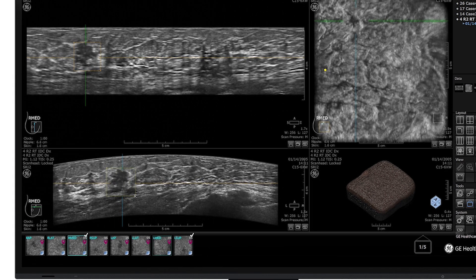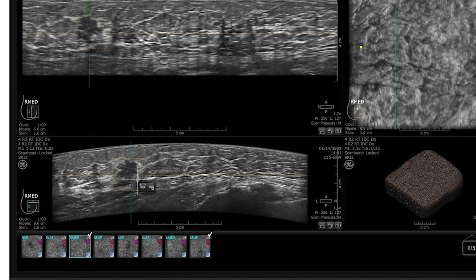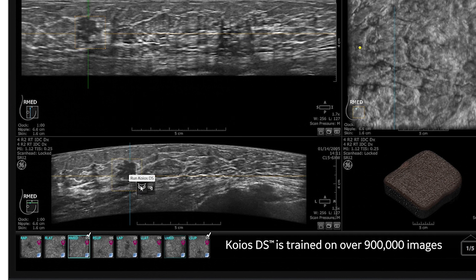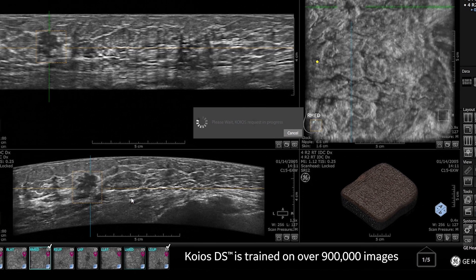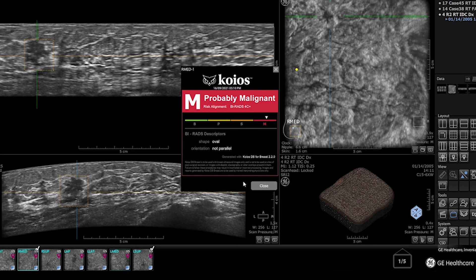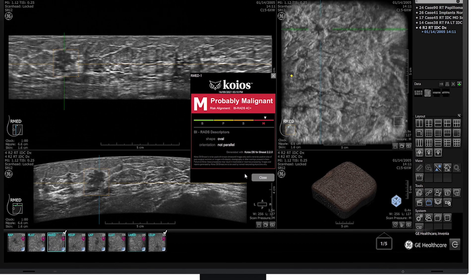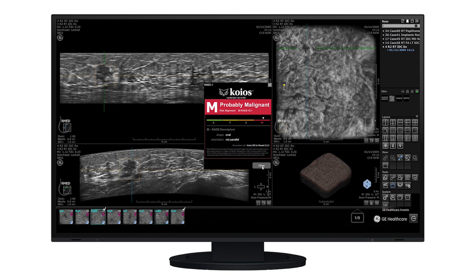After drawing a bounding box around the area of interest, the Kios DS Breast AI algorithm assesses the characteristics and assigns a probability of malignancy using the ACR-BiRADS classification. The addition of Kios DS Breast may assist in clinical confidence and decision making.